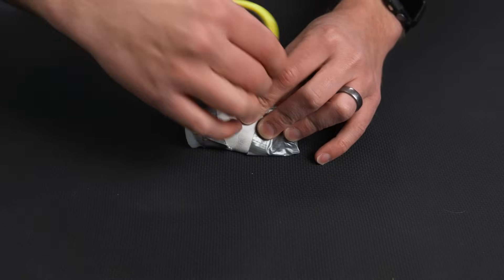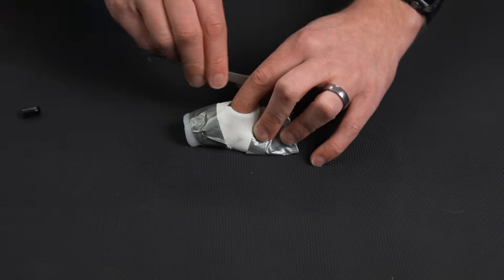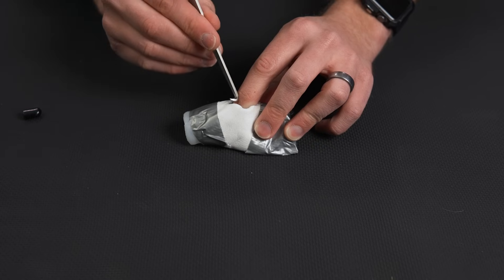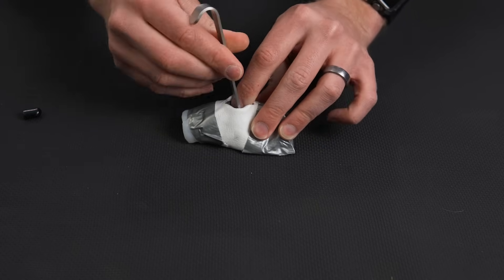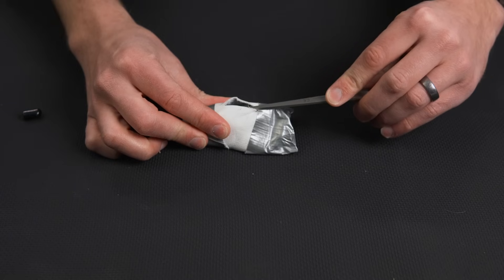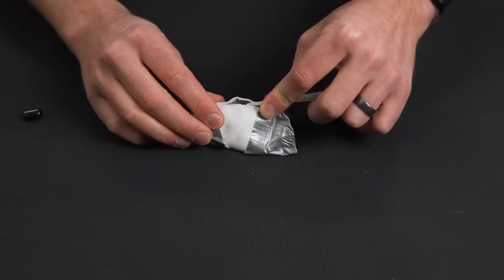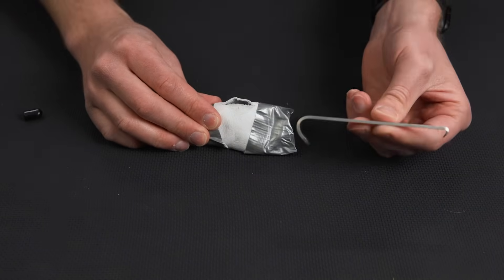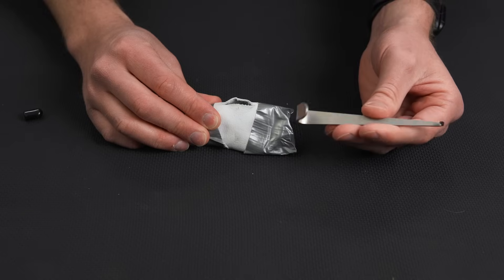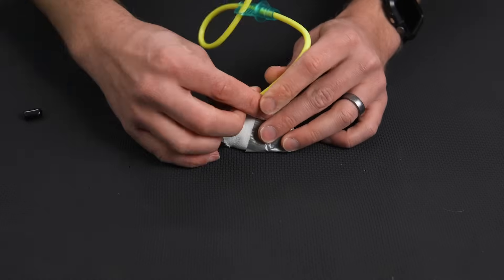Because if we release that, if we don't have a finger in there, we could actually lose the through and through hole we have. The skin could move and the trachea could move in an opposite direction. In a stressful environment, you will be unable to find it again. So it's really important to maintain this pressure and try to have a place saver in place. Now that could be your bougie, that could be your finger, or that could actually be a tracheal hook. I do not use tracheal hooks. I really haven't been extensively trained in them. I think it's a little bit cumbersome and I have better luck just using my finger as a placeholder and inserting the bougie on the other side.